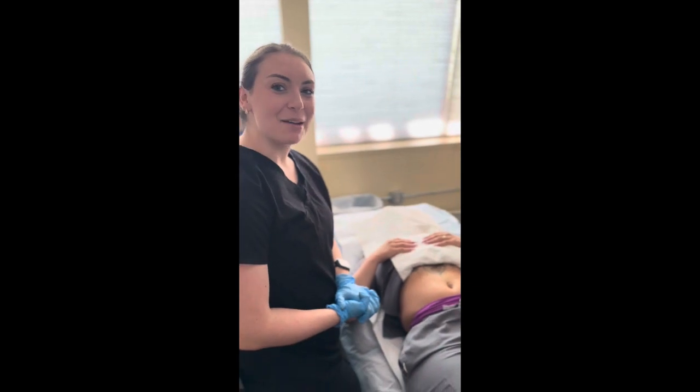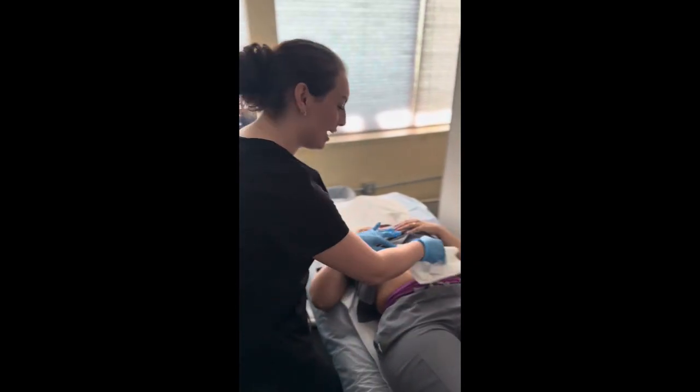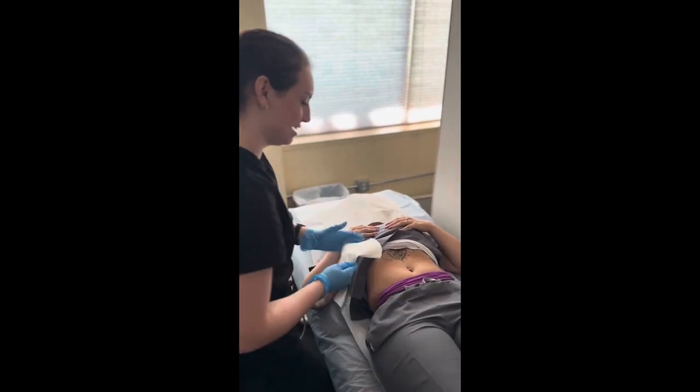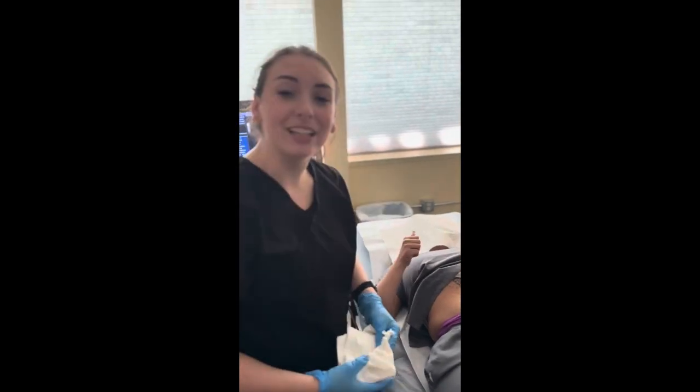Once the scheduled exam is all completed, of course you're going to take your towels and go ahead and clean off your patient. Make sure all the gel is gone. Ask them if they feel comfortable. Of course you're going to help them up and everything.